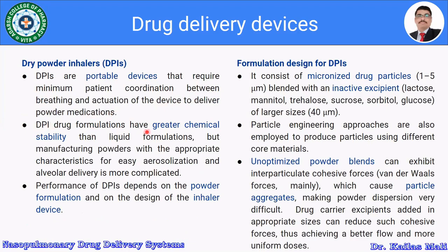DPI drug formulations have greater chemical stability than liquid formulations, like those in nebulizers or pressurized metered dose inhalers. But manufacturing powders with the appropriate characteristics for easy aerosolization and alveolar delivery is more complicated.